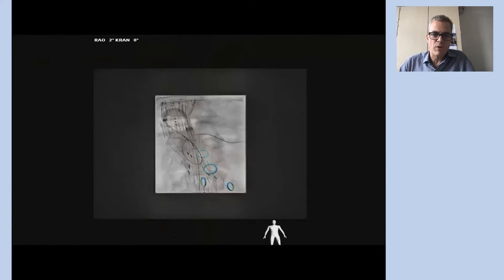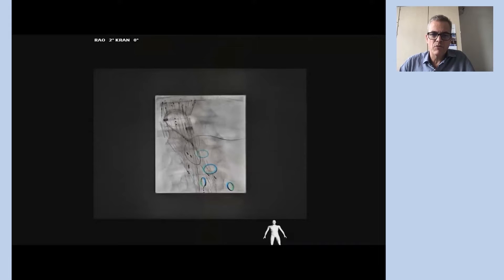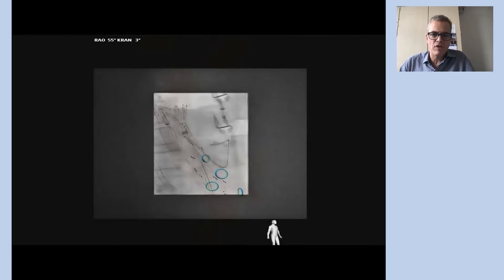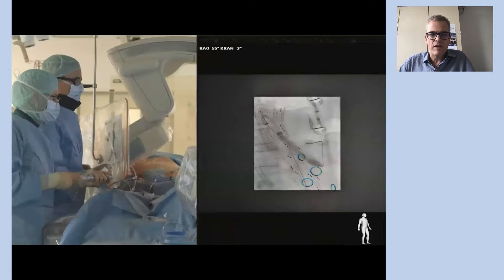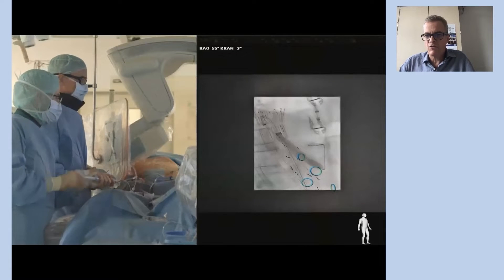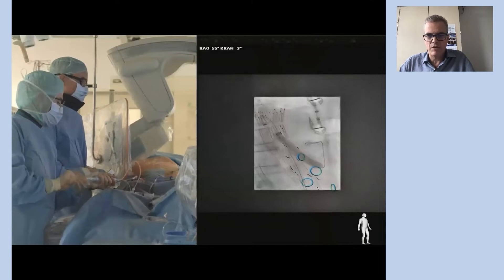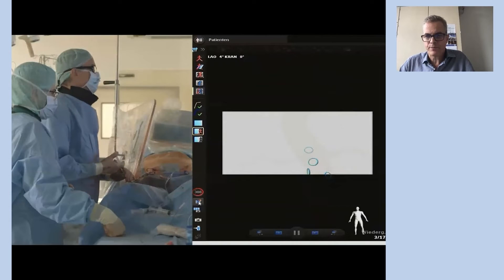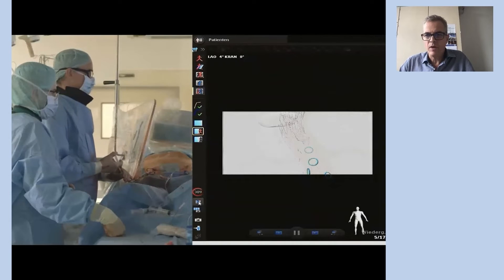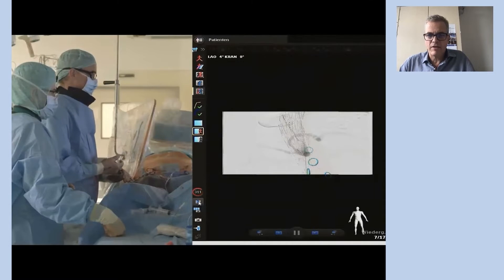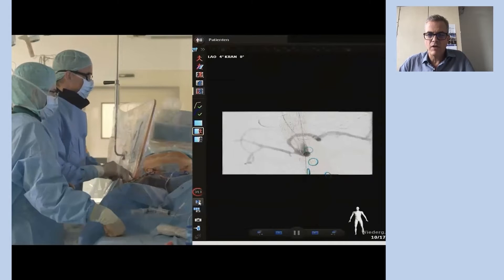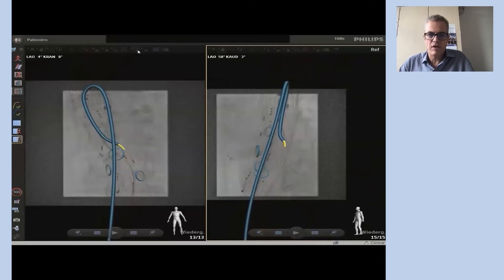The Rosen wire is put into place. Some parts of the procedure — like the bridging stent graft deployment shown here with the balloon-expandable covered stent — are not done with FORCE, as this requires fluoroscopy to visualize the materials. This is the selective angiography of the celiac artery.